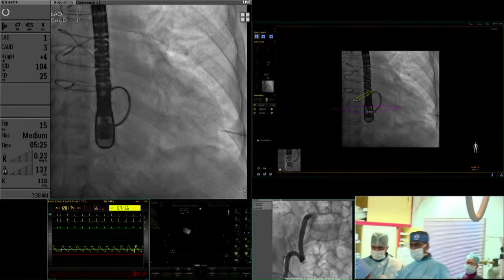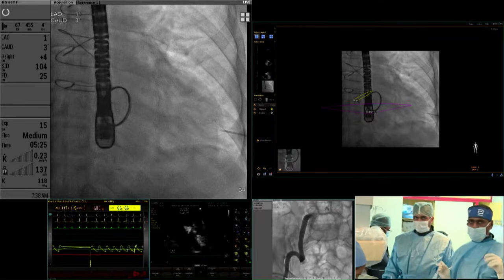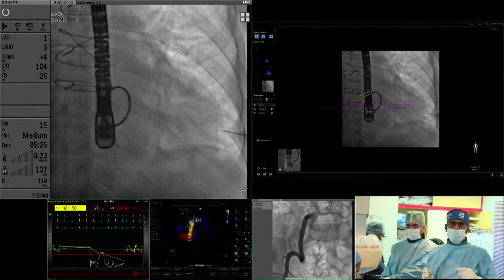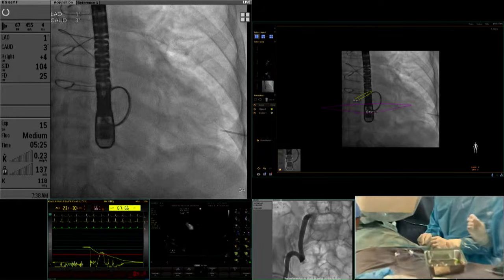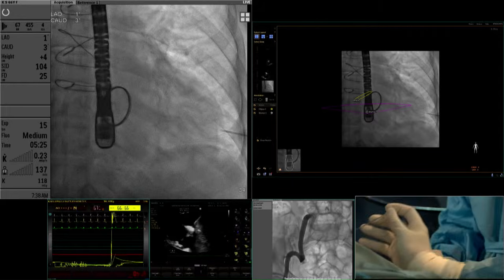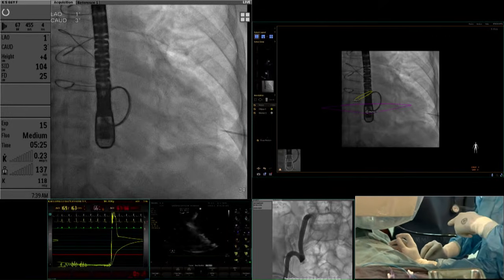As Dr. Srija has pointed out earlier, we have palpated the apex. Get ready to give apnea. So apnea and disconnect the ventilator. What we do is we give apnea for the patient, we disconnect from the ventilator, and allow the left lung to collapse. Can you see my finger? Go zoom in on it.